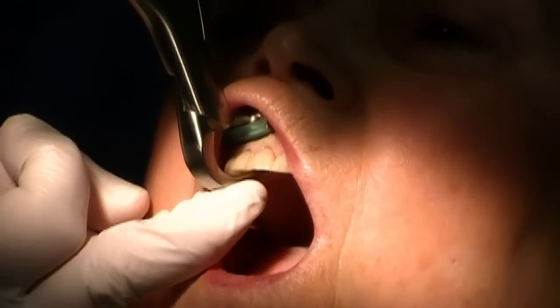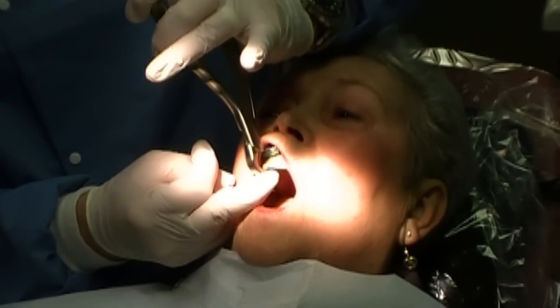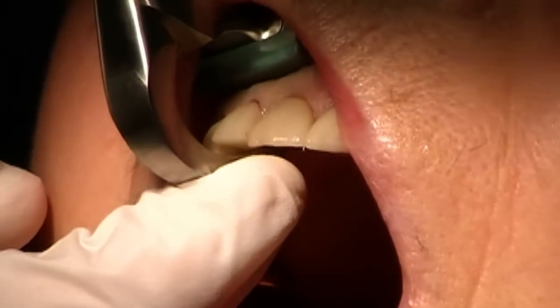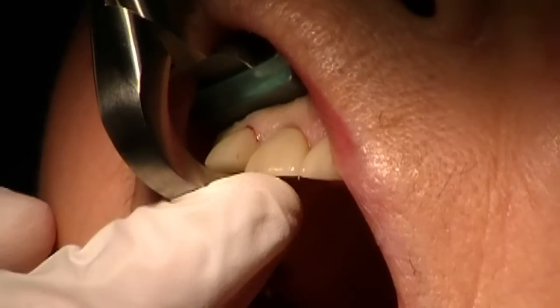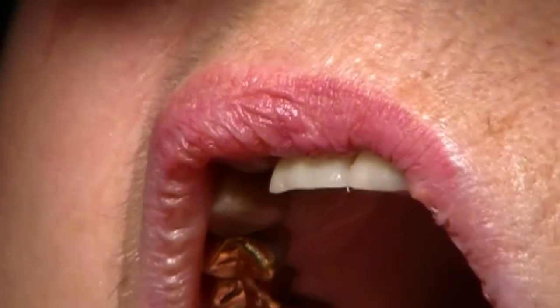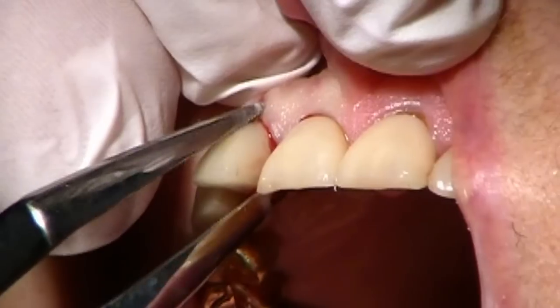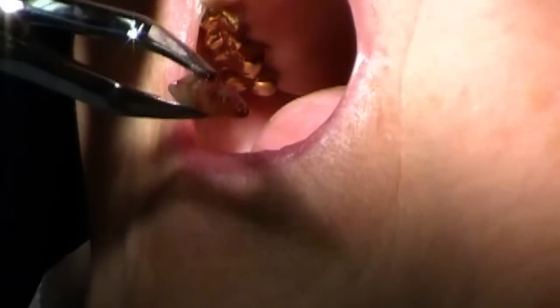Slowly, slowly, slowly rotating my wrist. It's starting to give a little bit. This is a crown, so sometimes a crown comes off first, but it's starting to come. And see the tooth move a little bit. Wow, and it just snapped. This is really magical. And then I'll just take an instrument to grab onto the root structure and finish the atraumatic extraction of a non-restorable tooth. And here you can even see the posts poking through. Really magic.